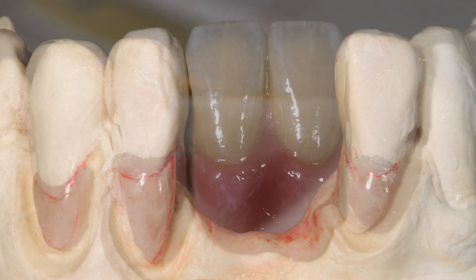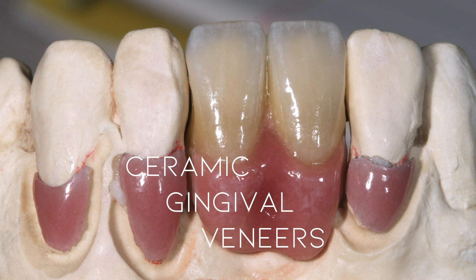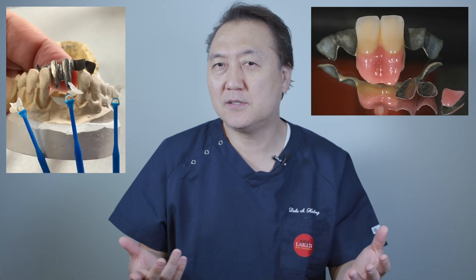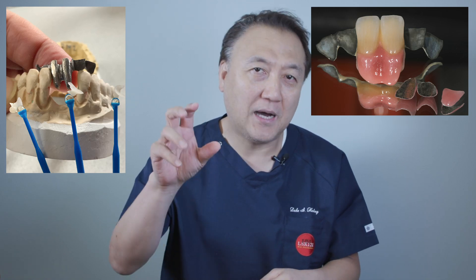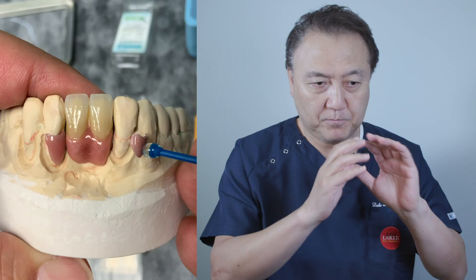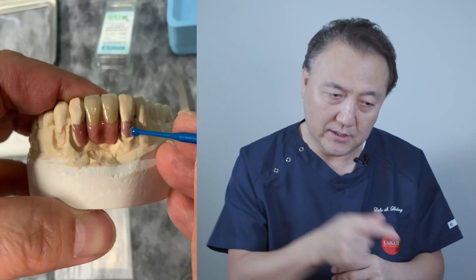We have a great case today. People are questioning regarding the tissue area, which is the gingiva area. Why make it ceramic? This is a different approach. Composite has more staining than ceramic. Regarding the natural teeth with root exposure, we're trying to make it pretty. I know it's crazy, but good crazy — because we're trying to improve it and make it better.